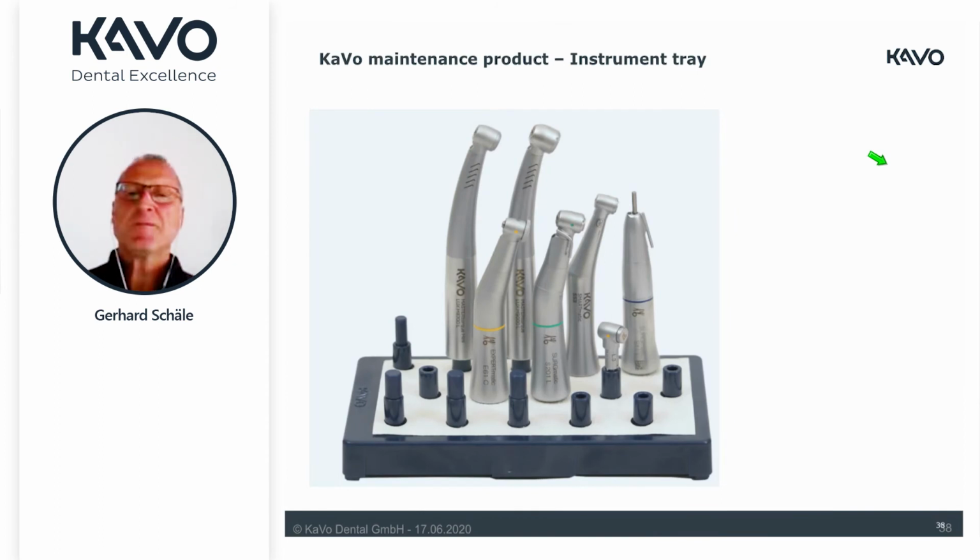After the cleaning, there are always discussions how to hold the instrument, to lay it, to stand it, to have the head upright, to have the head downwards. We clearly say here, we are using our instrument tray, which is, by the way, new and fully sterilizable and can also be used in the thermal disinfection. After using the instruments, if you do not wrap them and you sterilize them, you can place them on the instrument tray.